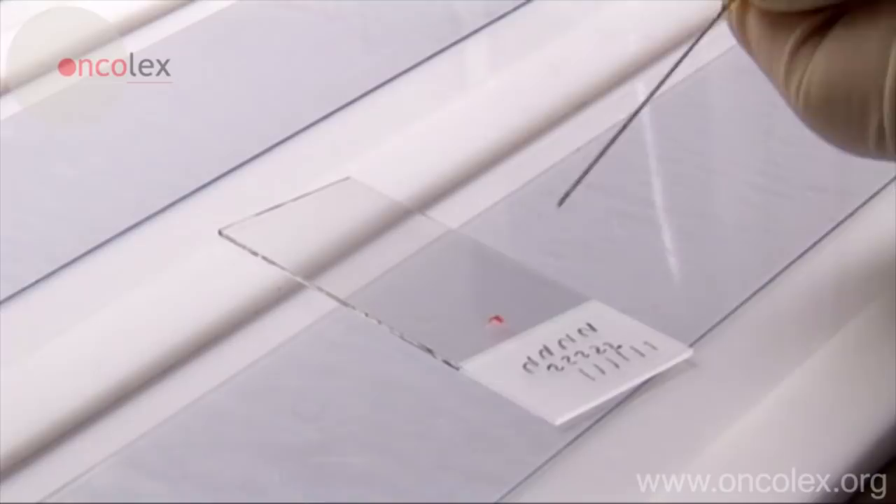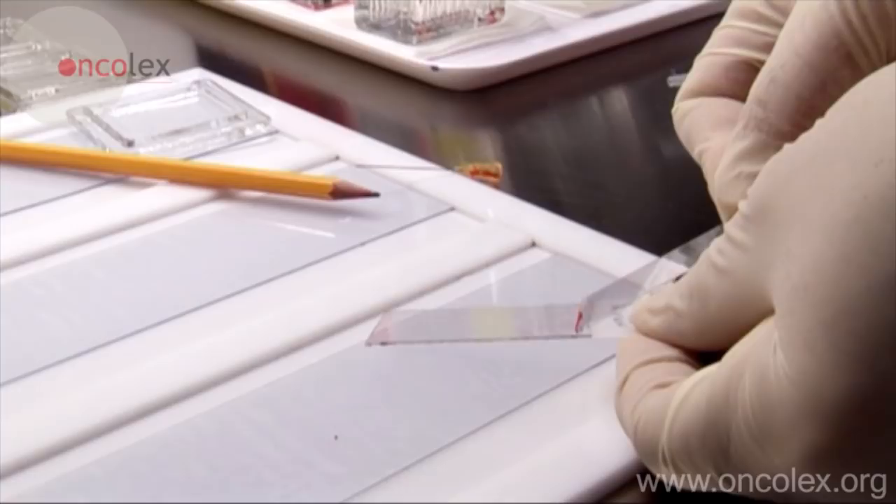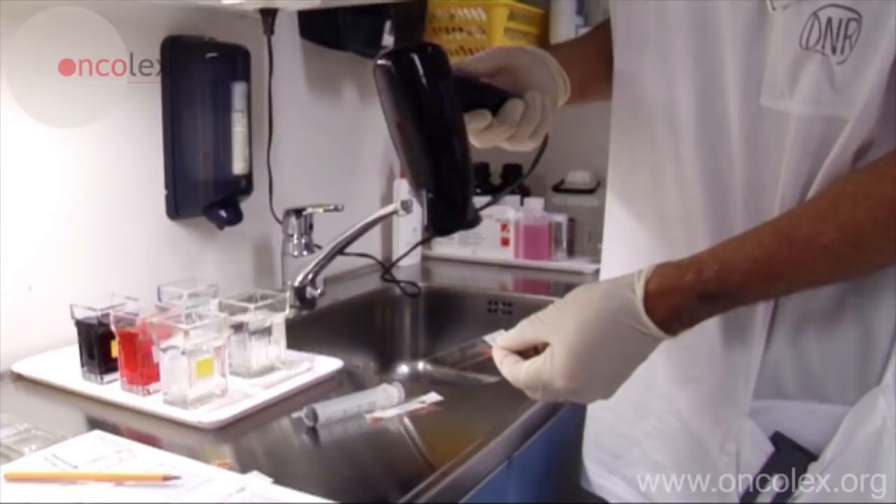After the biopsy, the material is carefully placed on a slide. Another slide is used to smear the material: collect the material with the slide and smear with one rapid forthright movement. The material is then dried under a fan before staining.